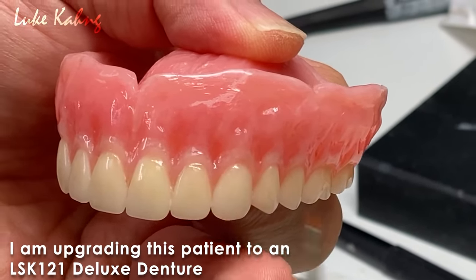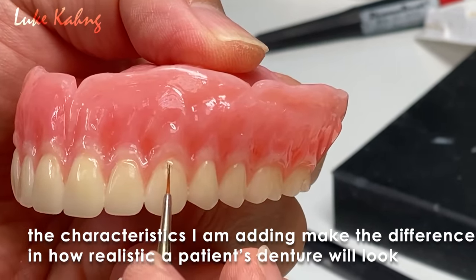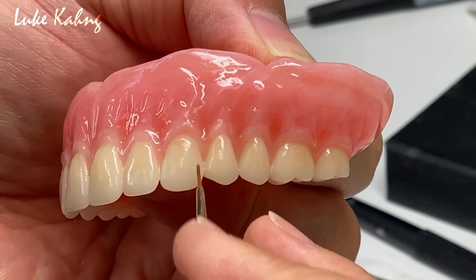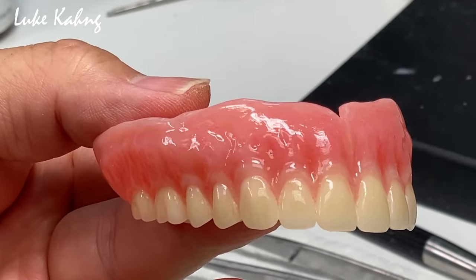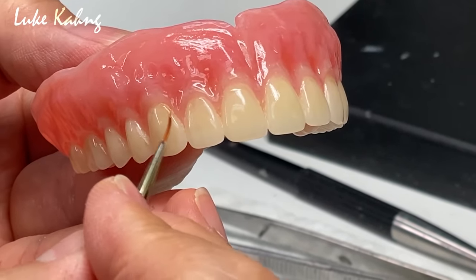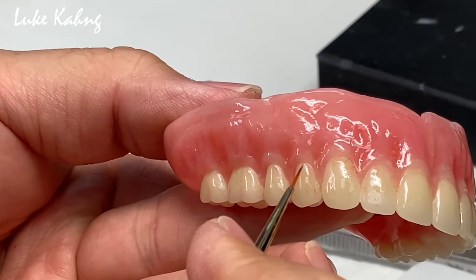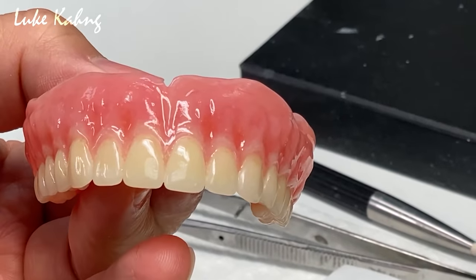Just a little bit darker. The gingiva area, just a little bit, okay. That was good. Right? No, too much. Right? Here, that was good. You can do with the ivory, with the incisor.